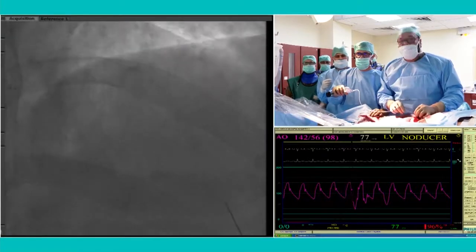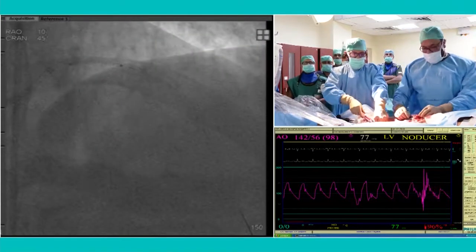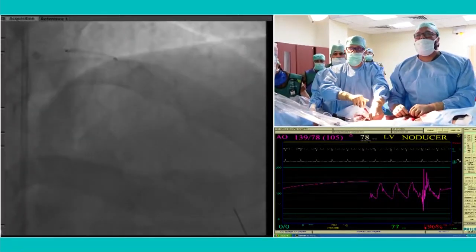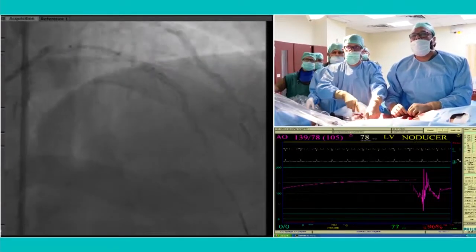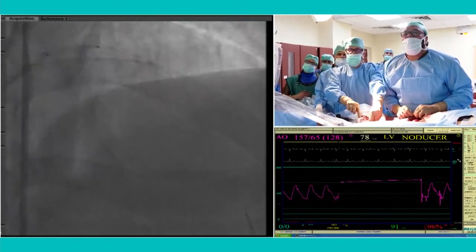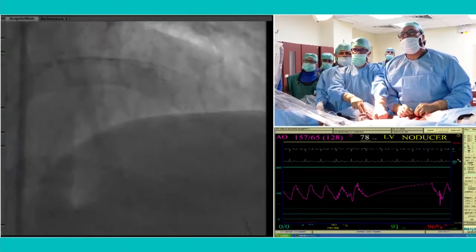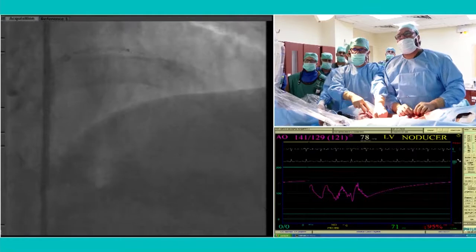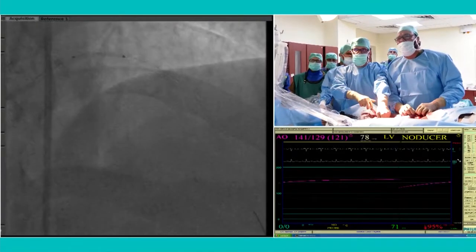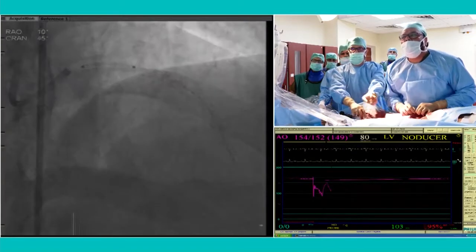Right, sir. Correct. Now after that you are planning for a TAP into the circumflex. Right, sir. Absolutely. We are too much into the LAD. So you are putting a stent from the left main to the LAD, and you are thinking that you may get 8 millimeters into the LMCA to do a POT, right? Yeah, around 10, sir. I think I'll get around 10 in the left main. I don't know whether the 18 will do that.